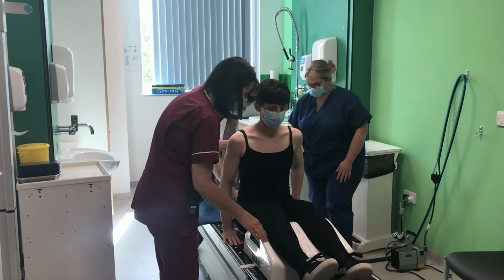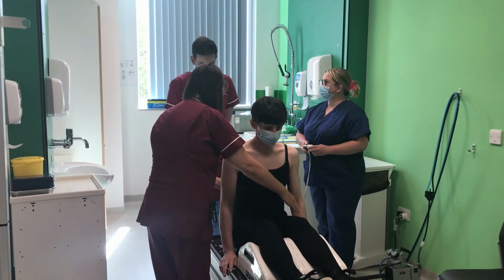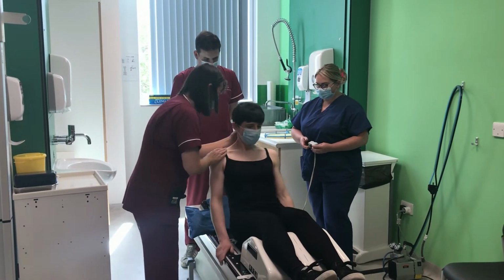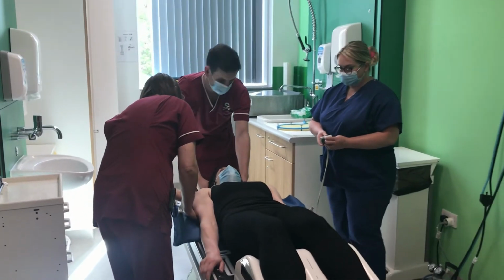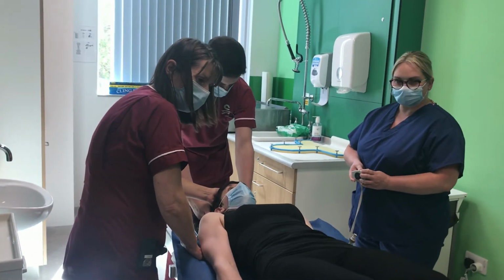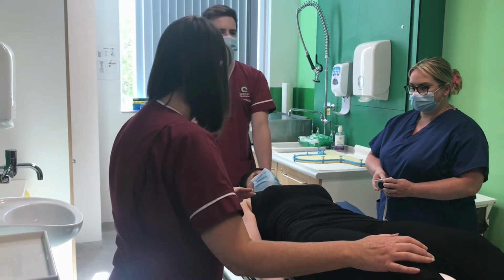You'll be first asked to lie down on a firm trolley. This is so that the correct measurements can be taken. Great care is taken by the members of the team to make sure that you are positioned correctly, and you'll be guided throughout the process. You will be asked to lie back on a special mat, and the table will be raised to a comfortable height.